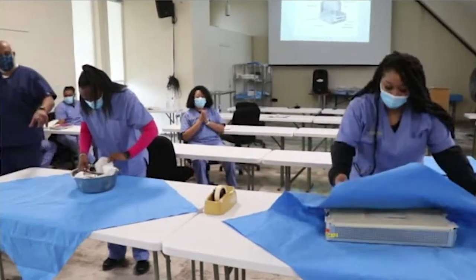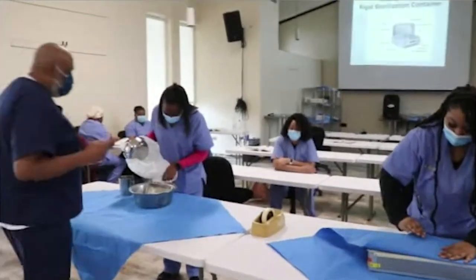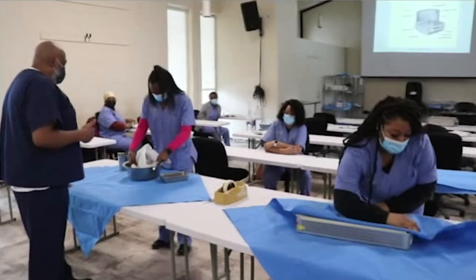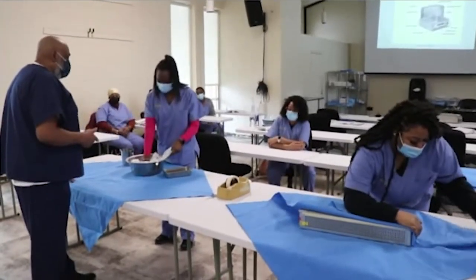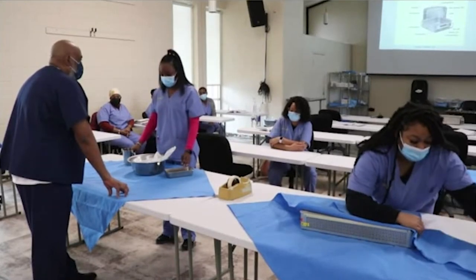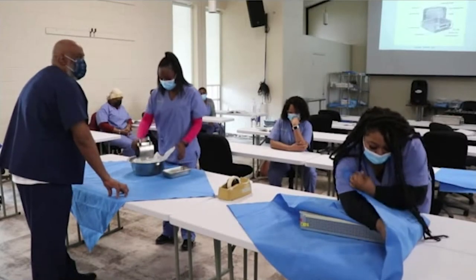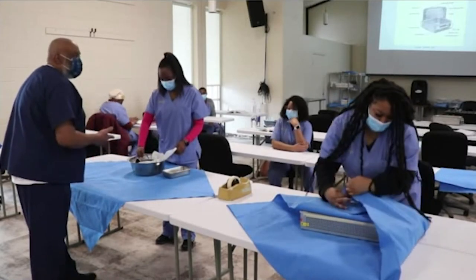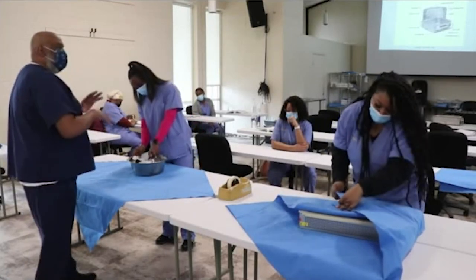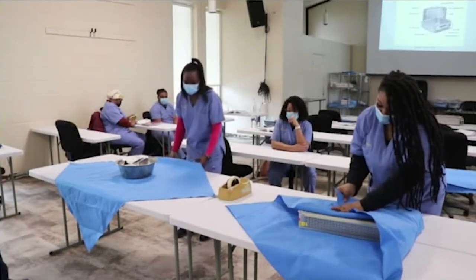Now, look what she's doing. Remember we said everything has a count sheet, right? If you're watching, Jessica is wrapping, and Jessica, you've got that tray liner in there. Why is that there? Because metal won't touch metal. And why is that important? Contamination. Condensation, good. So she is strategically wrapping this basin set so that it's kind of a barrier. Again, excellent. Show off your technique, ladies.